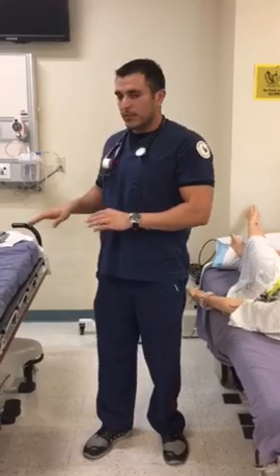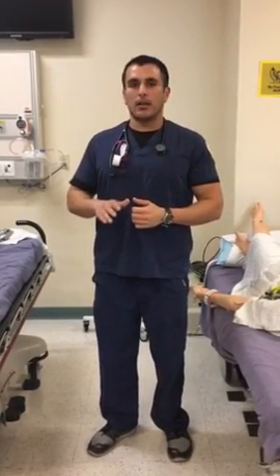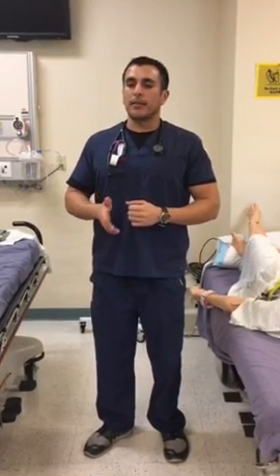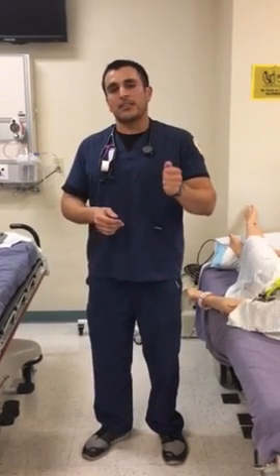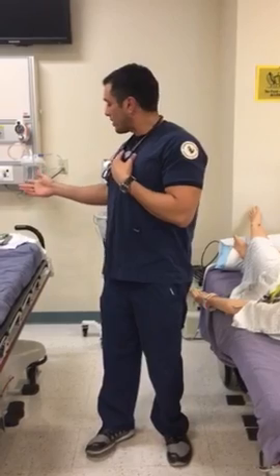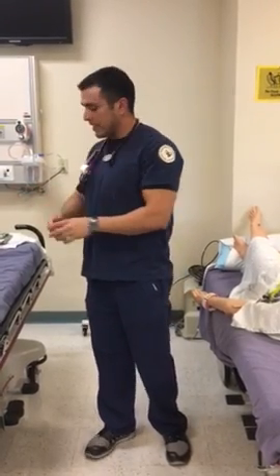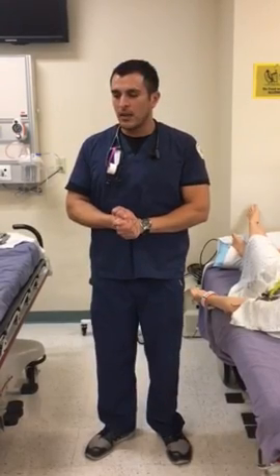Blade sizes that I typically see used are 3, and I also usually see the Mac blade used. The difference between the Mac and Miller is that the Mac goes into the vallecula and displaces the epiglottis indirectly, while the Miller, the straight one, goes under the epiglottis and lifts it directly. The maximum time that I would want to be away from oxygenating, so each attempt that I would take, is no longer than 30 seconds.